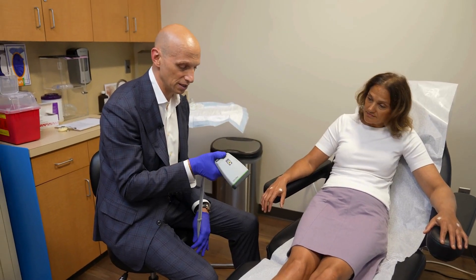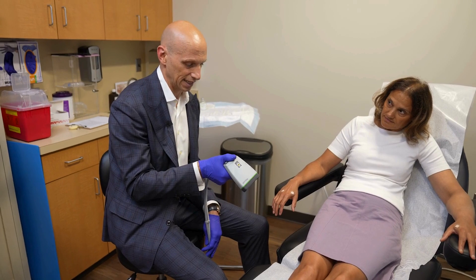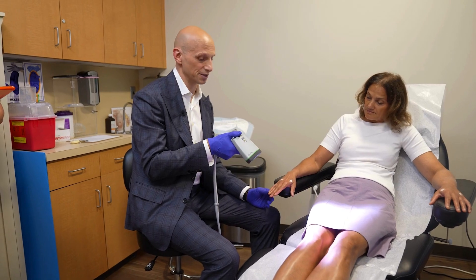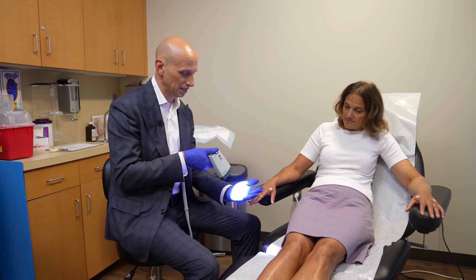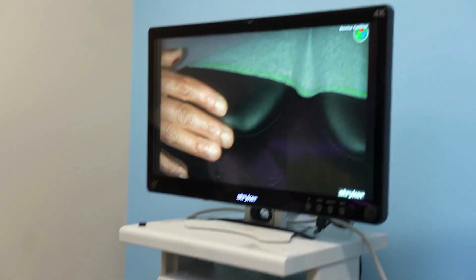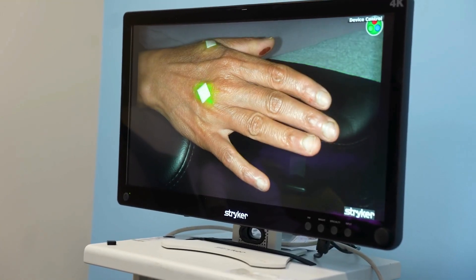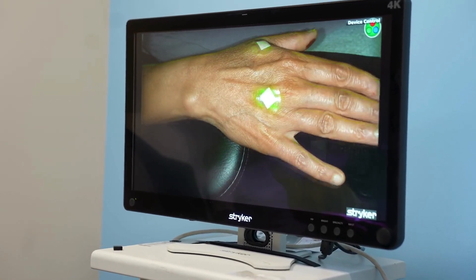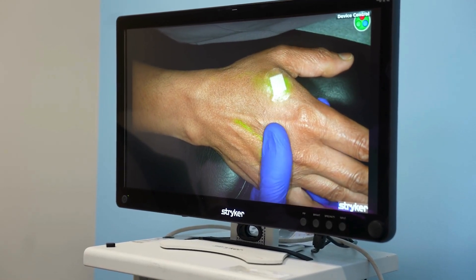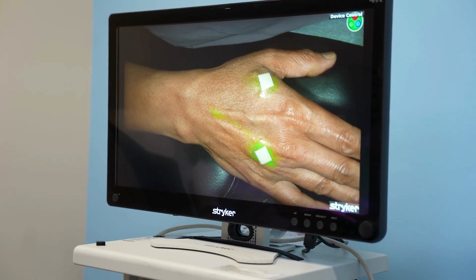This is an ICG. This is a near-infrared camera, and now we're in spy mode. There are a number of different near-infrared cameras that will cause the ICG to fluoresce, and if you look on the screen here you can start seeing the ICG — and there's a nice lymphatic right there.